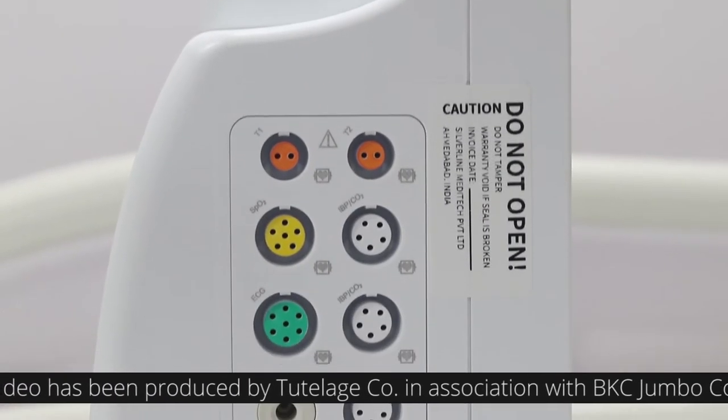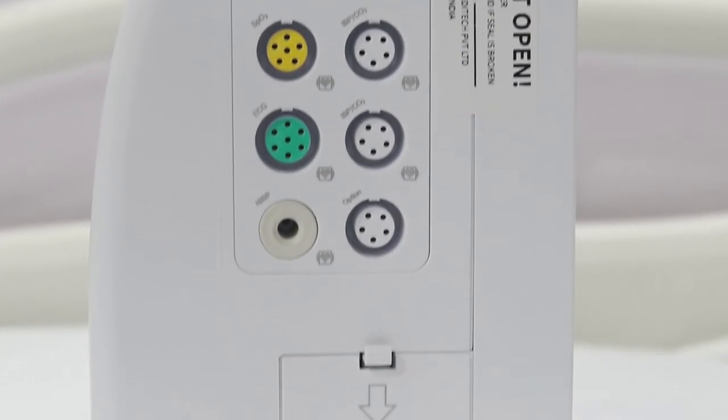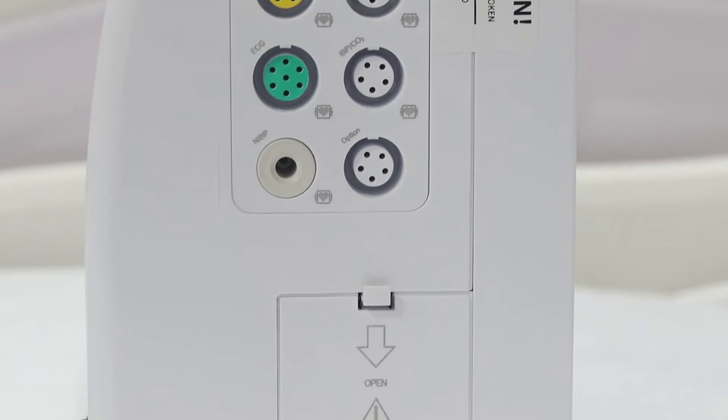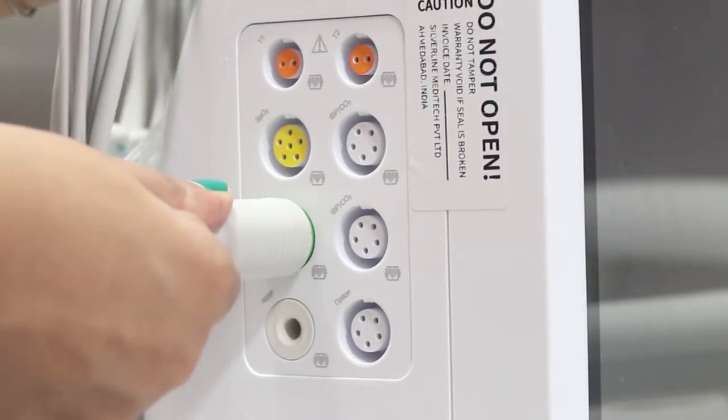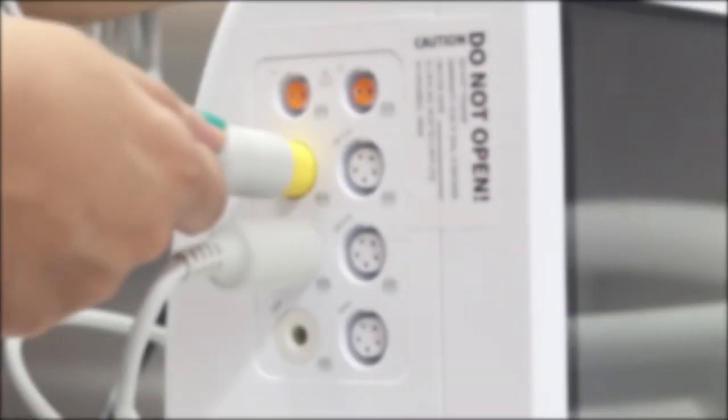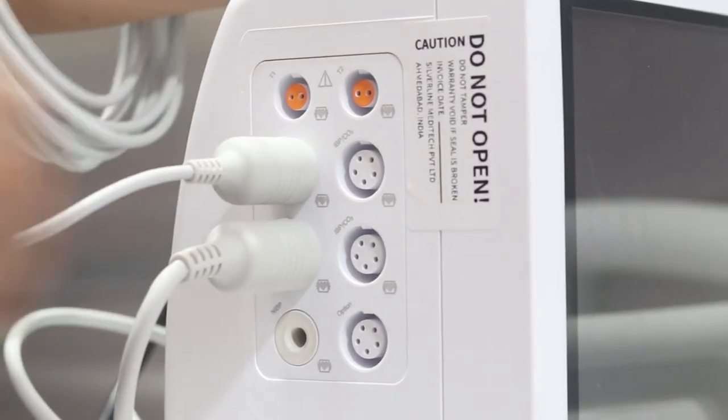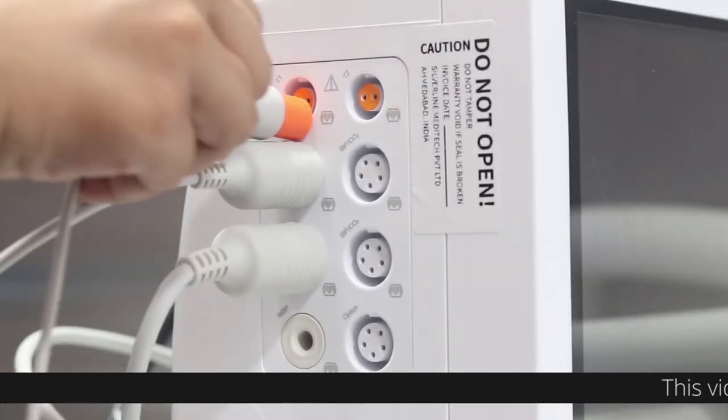The left panel has sockets which are color-coded with each probe. Plug into the green color socket for ECG probe, yellow socket for Oxygen Saturation Probe, and orange socket for Temperature Probes.